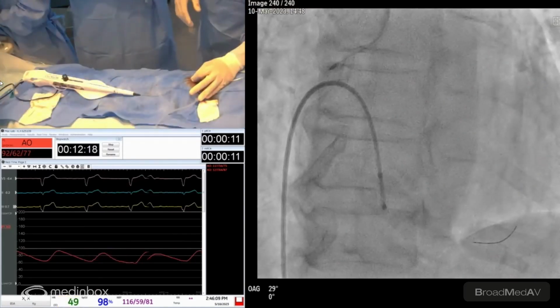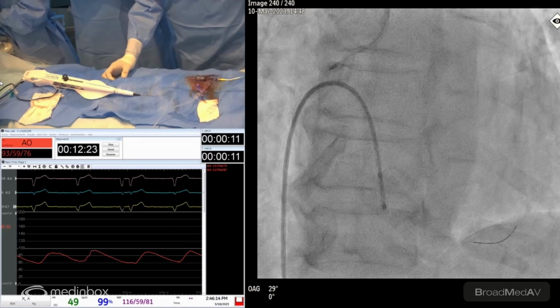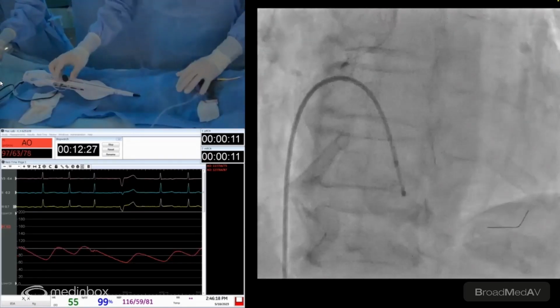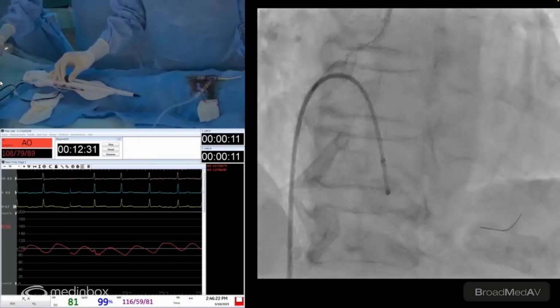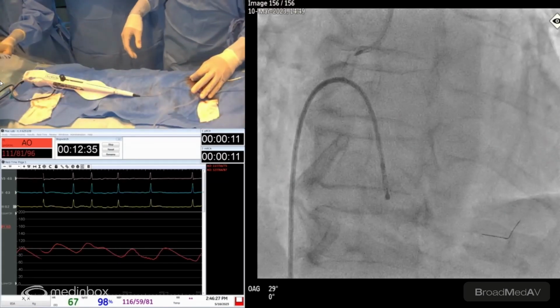So I think we're good with this burr. I don't know if you agree. You want to take a feel for it, see if it's smooth enough to your liking. Then we can escalate to 175. We'll do one final polishing. That's very smooth. Okay, so I'm happy to go to 175.